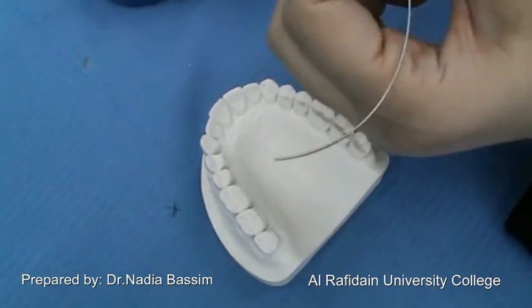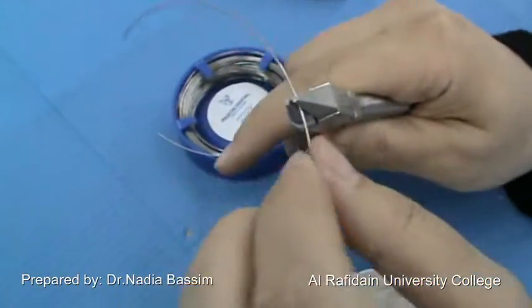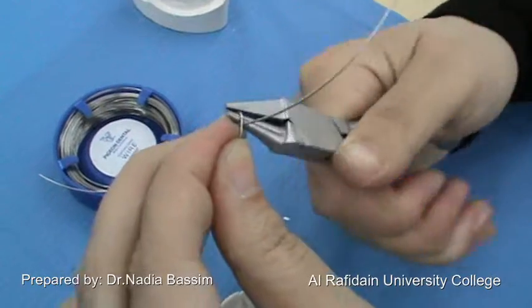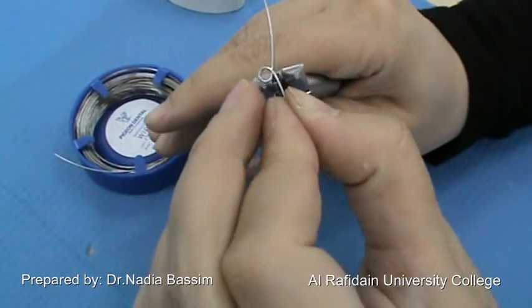Now we are going to make the modified BCR. The same gauge of wire — 0.7 mm — and the same components with only a very small difference: only in the end of the medial arm. Instead of the non-traumatic end, we are going to make a C-clasp — a U-shape and then a C-clasp.